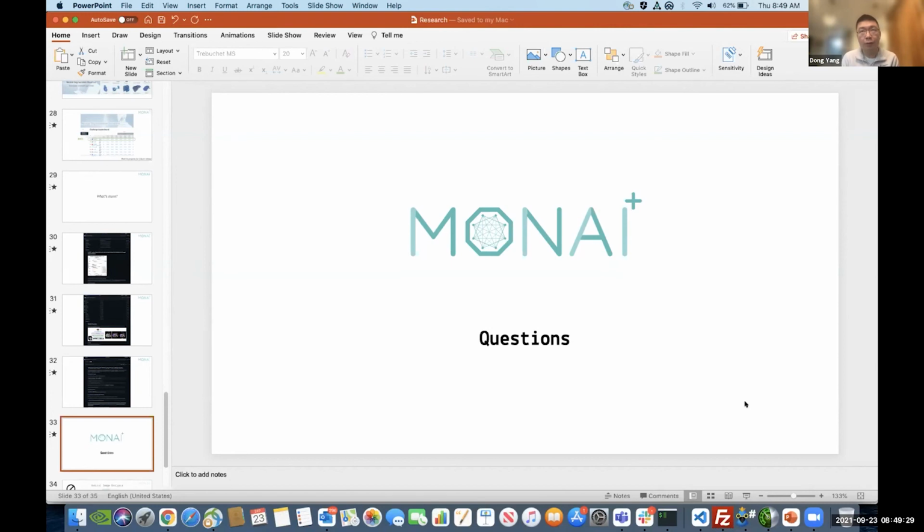But for organs and bones, it's better to have a large image patch size, because segmenting those objects may require a lot more global context. So a larger image patch definitely gives you more global context to help you make a better segmentation result. Great.